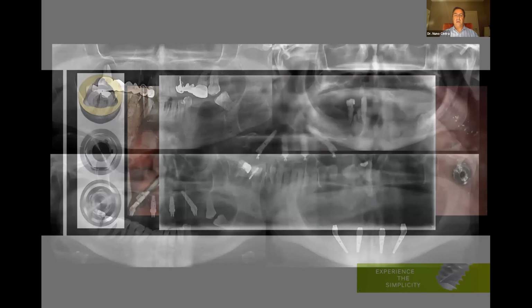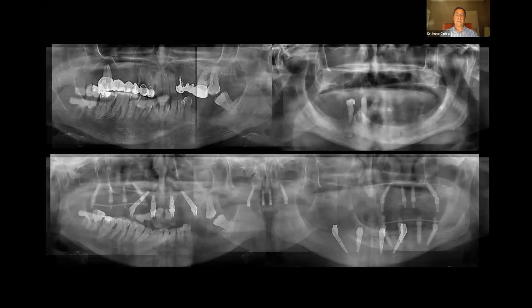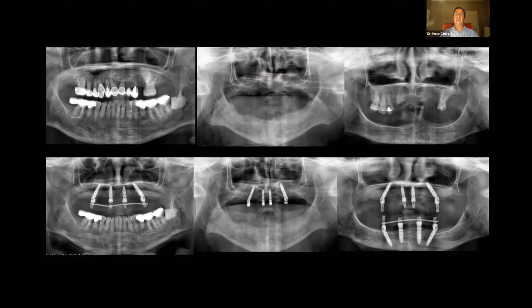Okay, so internal, external, X. I have several cases with internal, I have several cases with external, and as I said before, nowadays I'm using more internal connection.